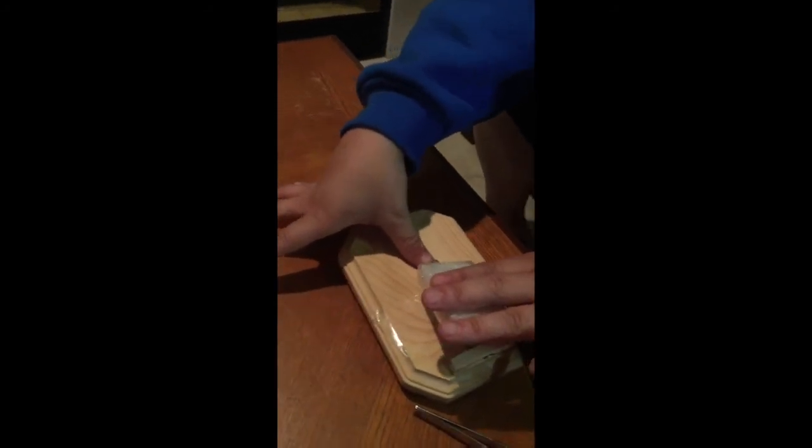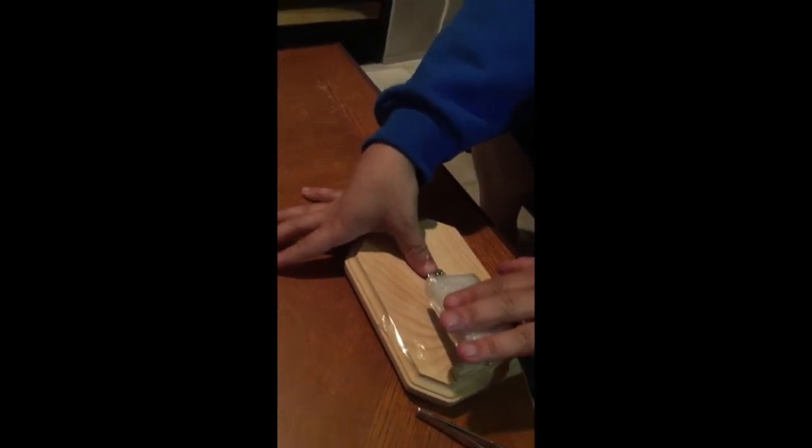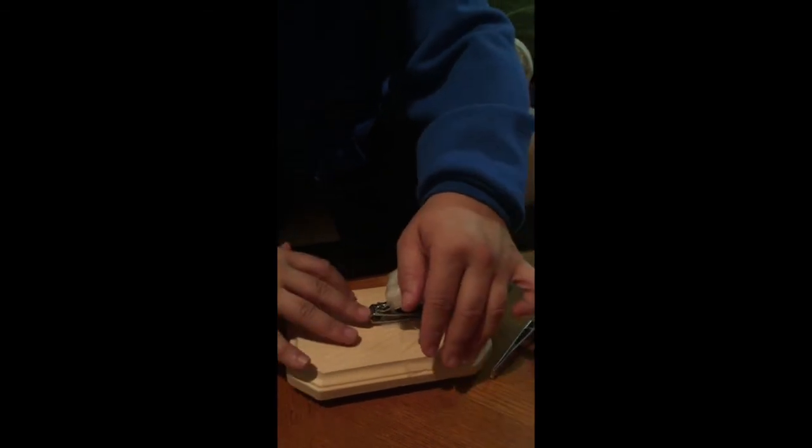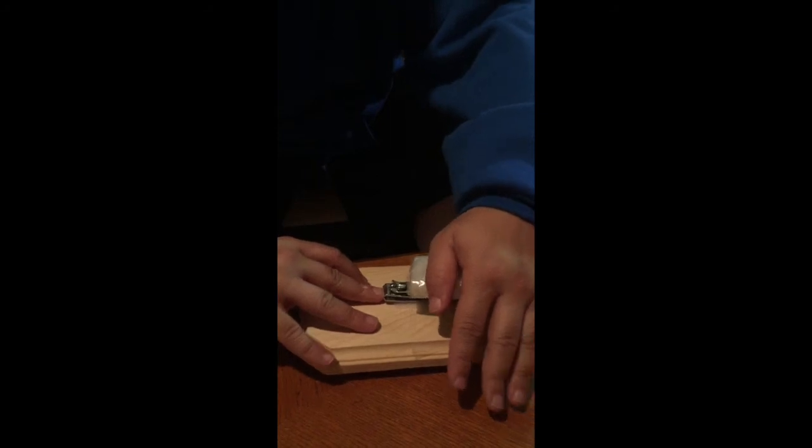Go ahead and put your hand in there. You can put it on the table. The table's better. And as you can see, he doesn't have to use his fingertips as much to cut his nails. So he uses his palm there, instead of his fingertips, to press down on the handle of the nail clipper.